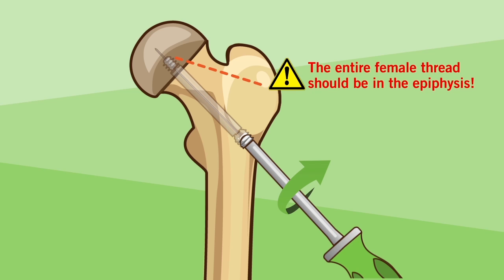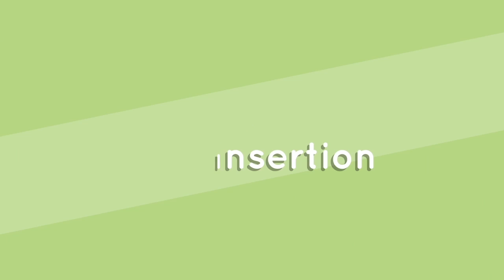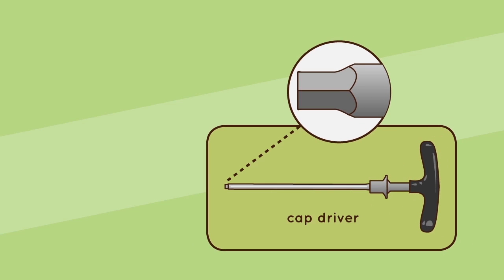Step 6, Cap Insertion: Using the cannulated cap driver, insert the appropriate cap into the male component. Drive the cap until it is fully engaged within the male component.